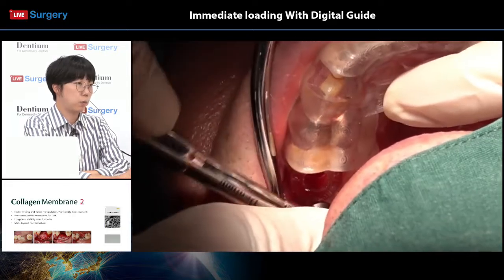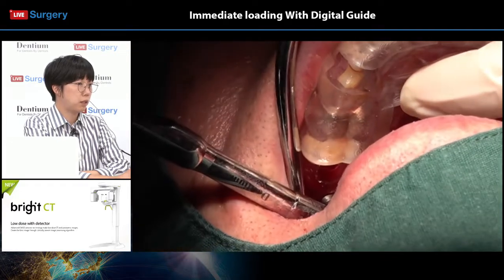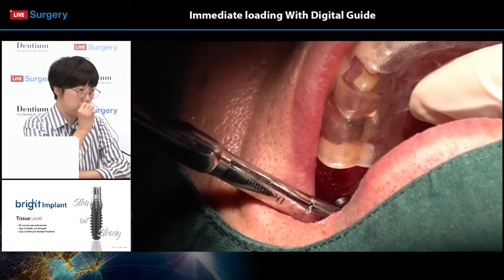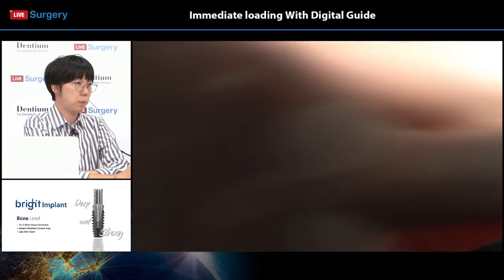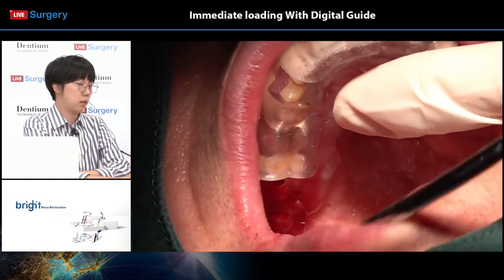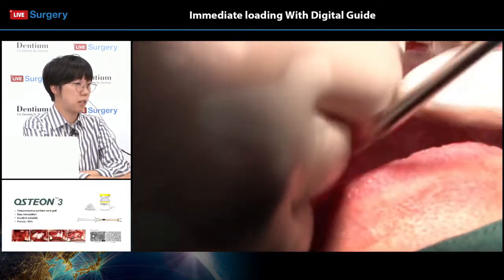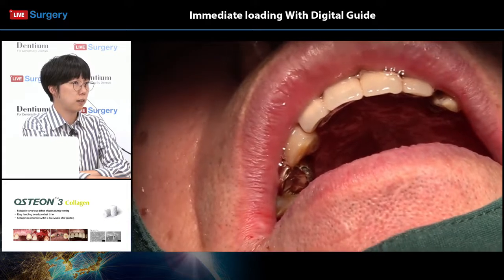Okay, so when using a surgical guide, usually a flapless surgery method is used, as in this case, but it's always possible to actually reflect the flaps because by doing an open surgery, there are many pros. The best thing is that you get a lot of visual access to where you're preparing.